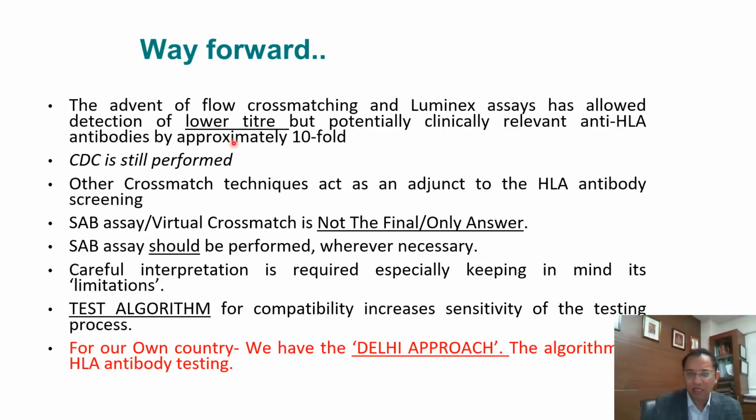These are very sensitive tests, but at the same time we have not so sensitive, specific tests like CDC, which is still being performed. It's a necessary evil. Many call it the in vitro transplant. Then there are other cross matching techniques, but single antigen is also there. Virtual cross match is there, but this is not the final or the only answer. You have to have a battery of tests that you employ.